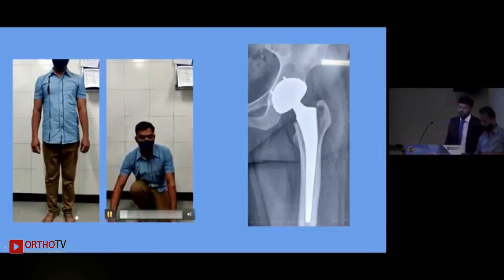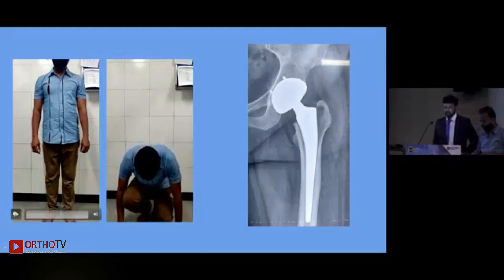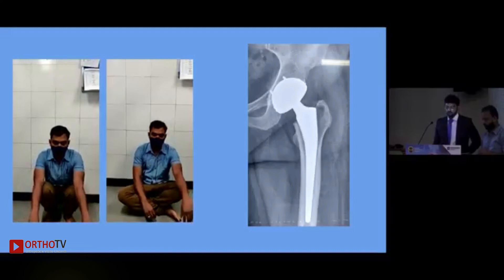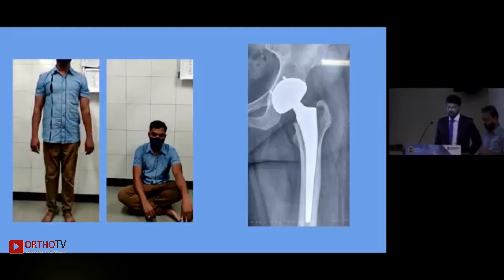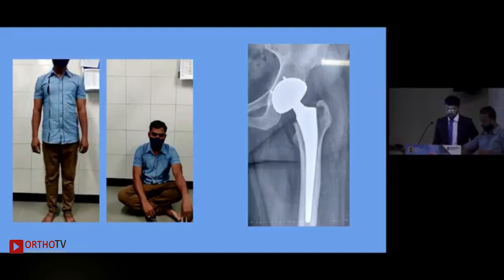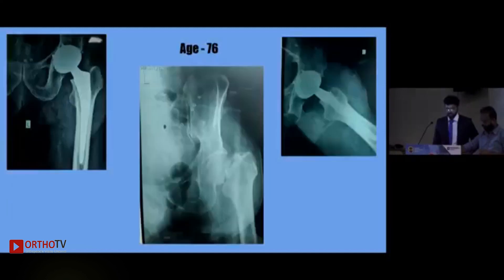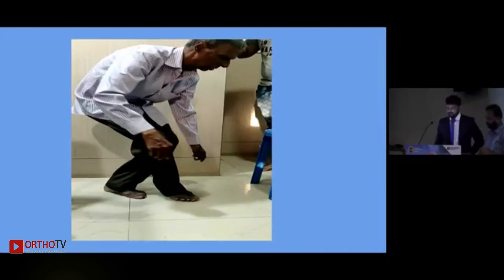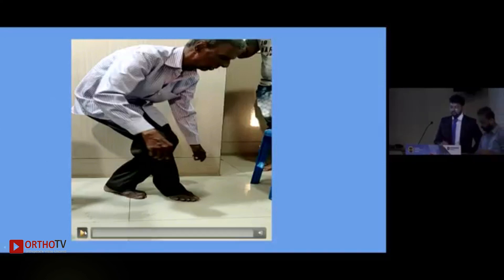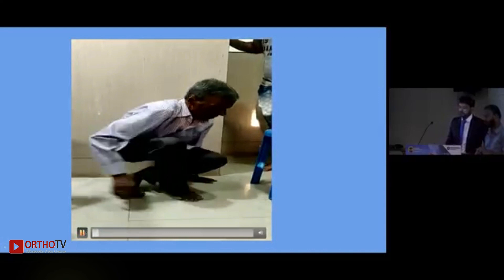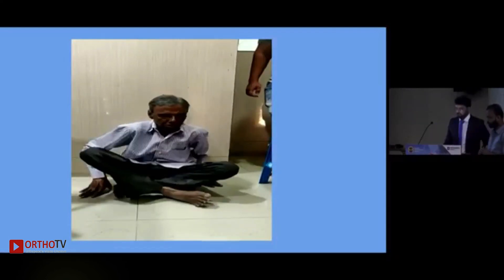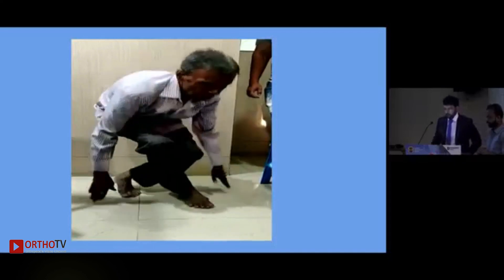Here is a unilateral dual mobility hip done in a 36-year-old patient. This next case is a 76-year-old patient with a fracture femur. I used a hybrid fixation — uncemented in the acetabulum and cemented in the femoral stem. The patient achieved full range of motion and is able to sit down, walk, and squat.